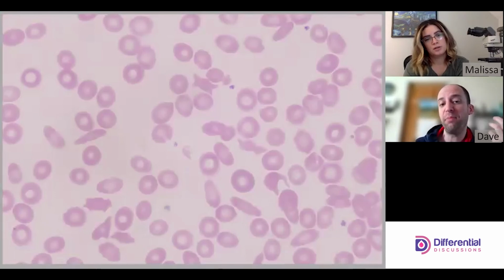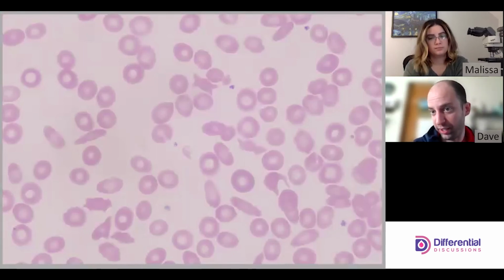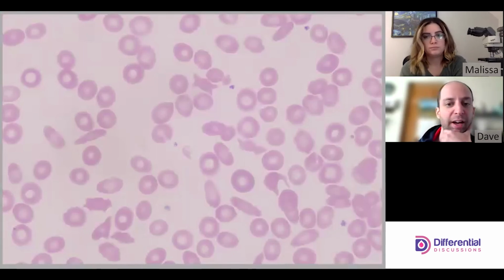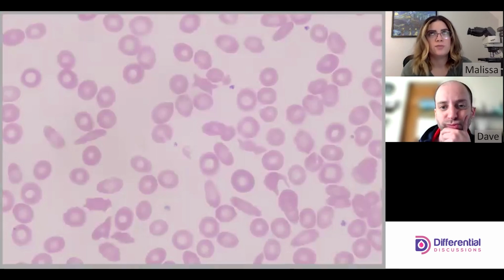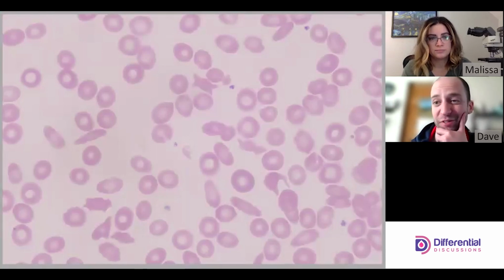Yeah. I also want to be mindful that some of the acanthocytes I'm seeing are kind of elongated to a degree, right? So I'm sort of sensitive to that. So I might say elliptocytes. Yeah. And then I'd want to look around some more, but we haven't been seeing as many acanthocytes. So I'm wondering if those acanthocytes were artifact. In hindsight, I think they almost certainly were. Yeah, although I appreciate that there were artifacts.